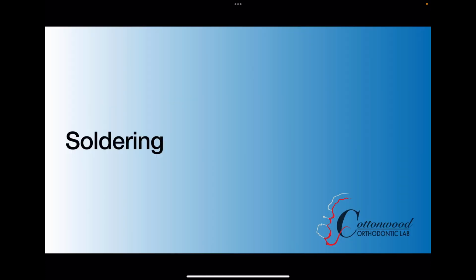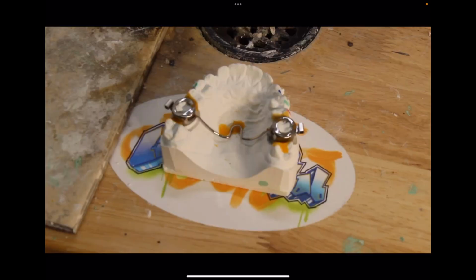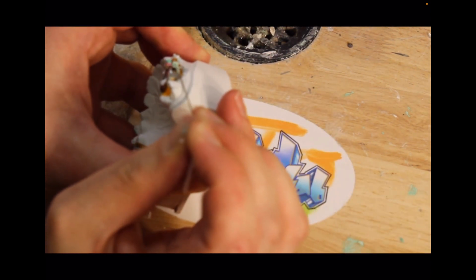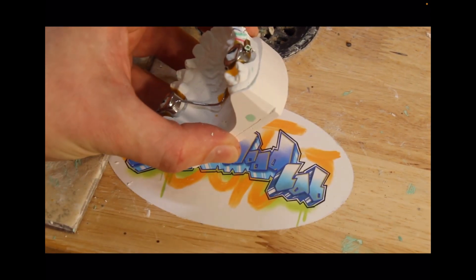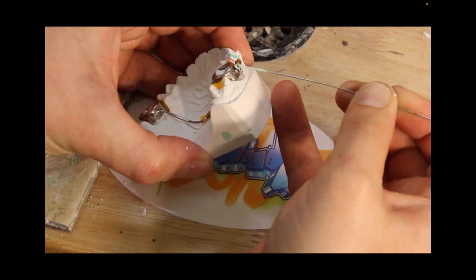Okay, next on to soldering. This is great because we're going to just quickly go through what we do. We want to first examine what we do to prep for soldering. We're going to use anti-flux first and prep the appliance for soldering by adding this anti-flux. This ensures that no solder flows into any of these tubes or covers any part that we find functional. I did speed this up by 1.5 times, as you see here.